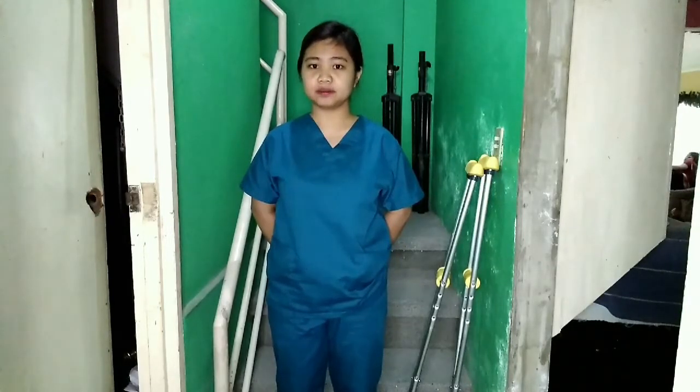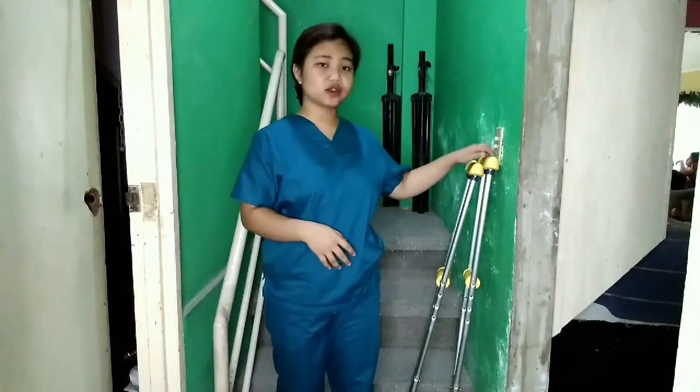Also consider having your patient ascend stairs from a seated position if necessary, moving the crutches upstairs as he or she goes. And lastly, help our patient to descend stairs using these crutches.